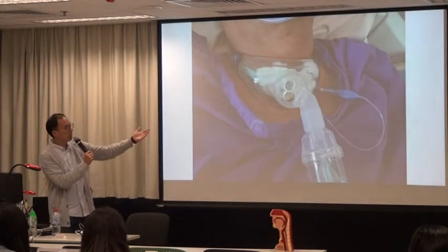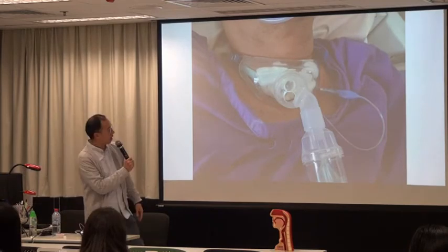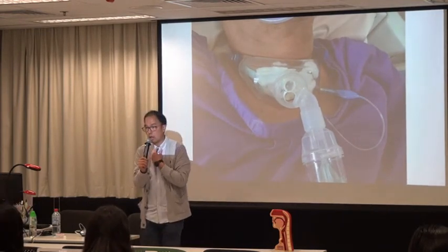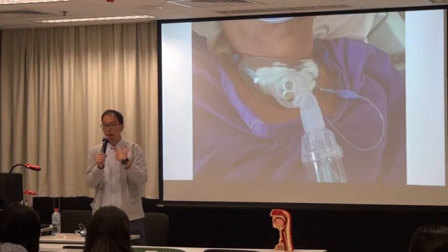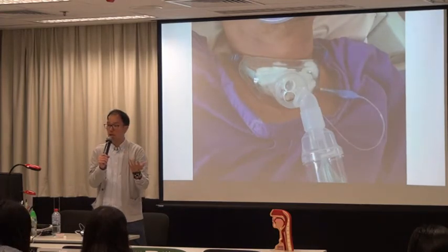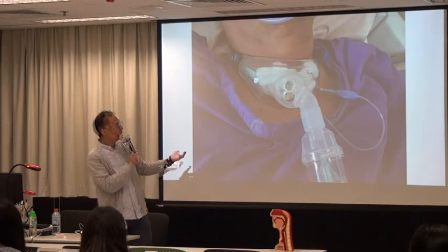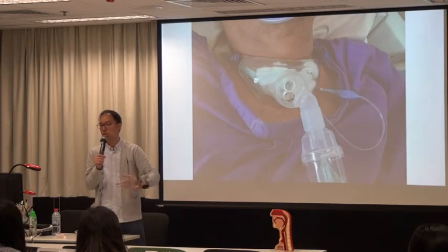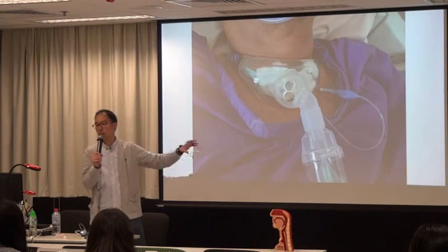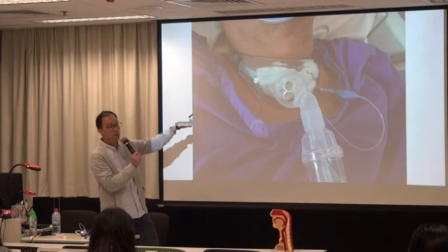Now, this would be a very common setting that we see when we approach a patient. This is how a tracheostomy would look. A few things I've mentioned to you. What is this? This is just a tracheal mask. So if the patient is on a tracheostomy and needs oxygen supplement, how is he or she going to get it? Not through the nasal cannula, right? Patients who need oxygen and don't have a tracheostomy get oxygen through the nasal cannula. But if you see a patient who has a tracheostomy and is getting a nasal cannula, then you know something is wrong. Either the nurse is not awake or the patient has some anatomical anomaly. Okay, this is connected to the O2 to give the patient oxygen.